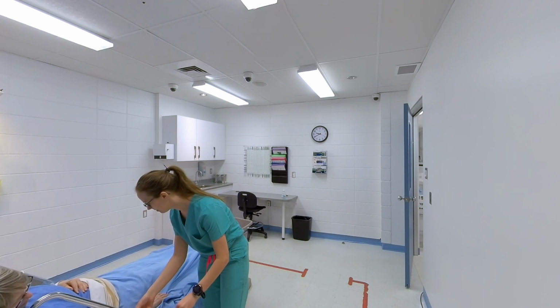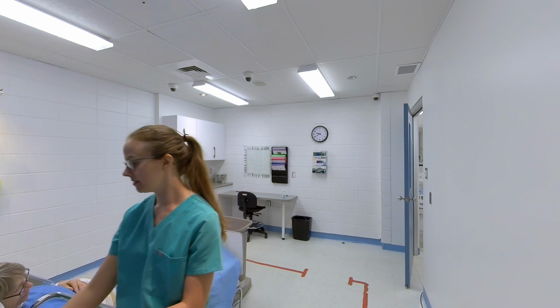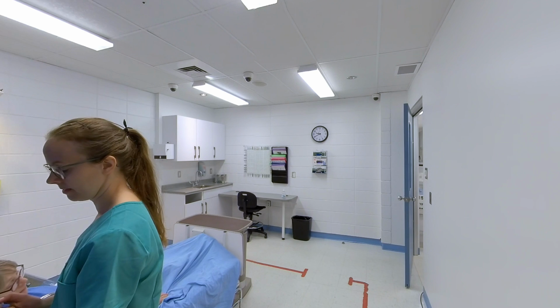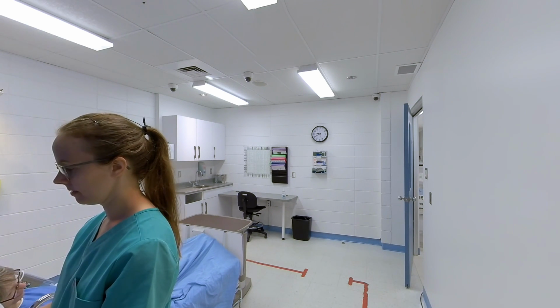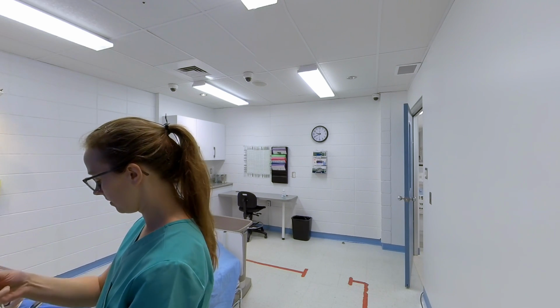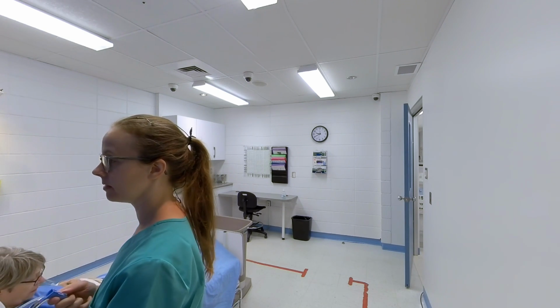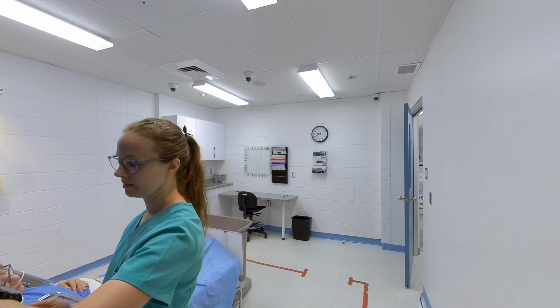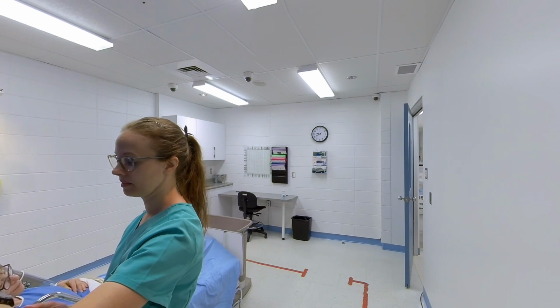IV infusion can serve several purposes: hydration or a means to inject medication, for example. A flexible catheter is thus inserted by a nurse with tubing attached. Sometimes infusion is controlled with a volumetric pump. The nurse is responsible for the proper working of the IV infusion and volumetric pump.